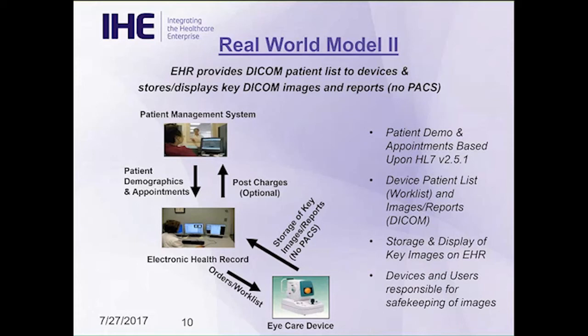If you want an archive and you want to store all the data possible that an IHE device generates, then you need an image management PACS system. The EHRs are not set up to do that. But what happens now is they can store the key images.